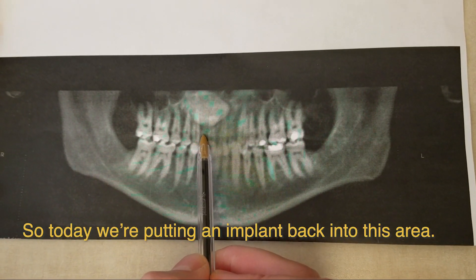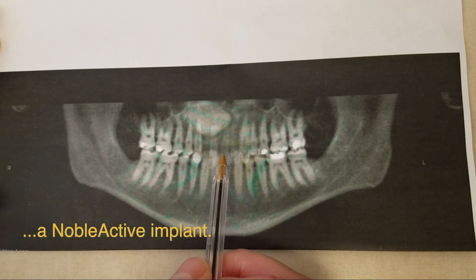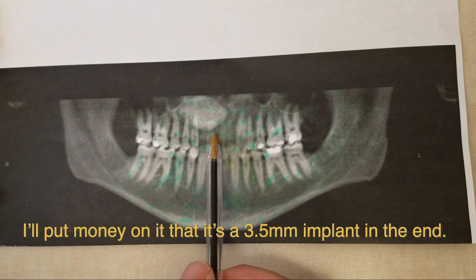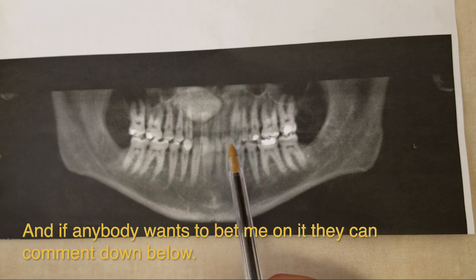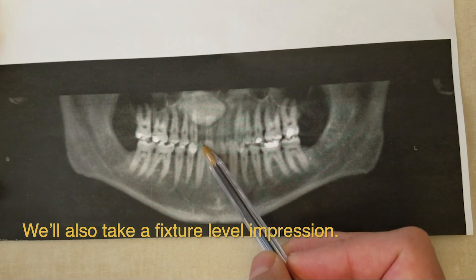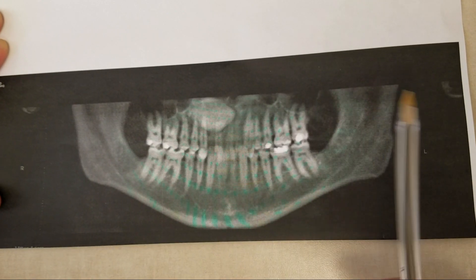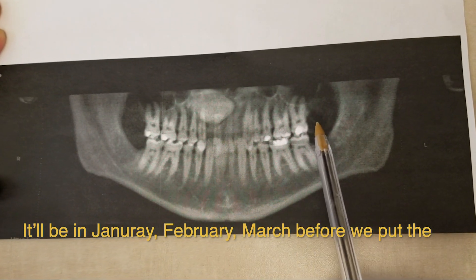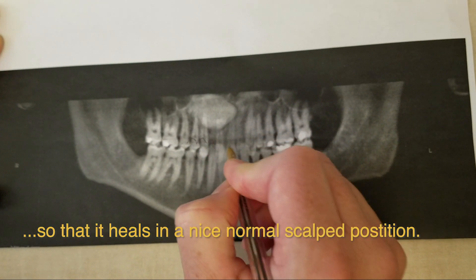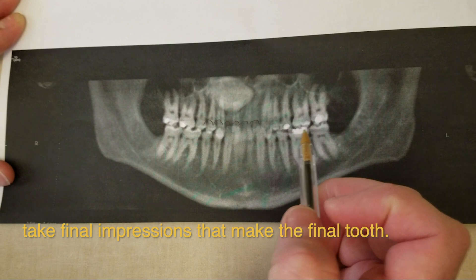It's what we call tooth number seven. Today we're going to put an implant back into this area. I've gone back and forth between a 3.5 millimeter and a 4.3 millimeter Noble Active implant — Noble Active is the brand. I'll put money on it that it's a 3.5 millimeter implant in the end. A 3.5 by 13 implant is what we're shooting for. We'll also take a fixture level impression, meaning a mold, which will allow us to make a temporary tooth. It's currently August and it'll be January, February, or March before we put the temporary on — it's used to guide the gum tissue so it heals in a nice normal scalloped position. It takes 10 to 12 weeks to get in that final position, and then the restorative doctor will take final impressions and make the final tooth. So let's go check this out.